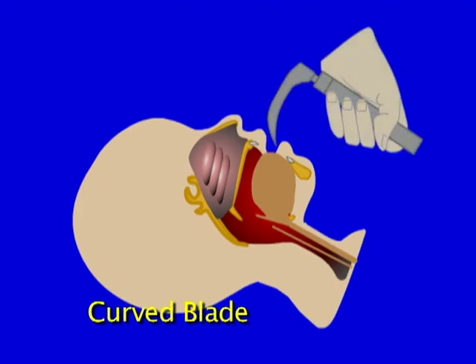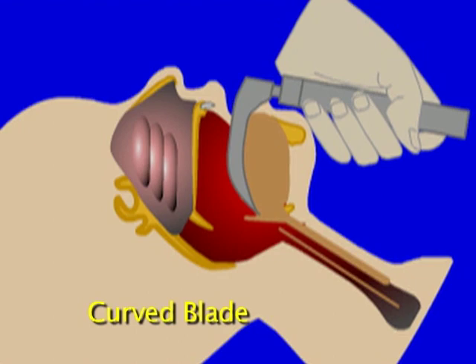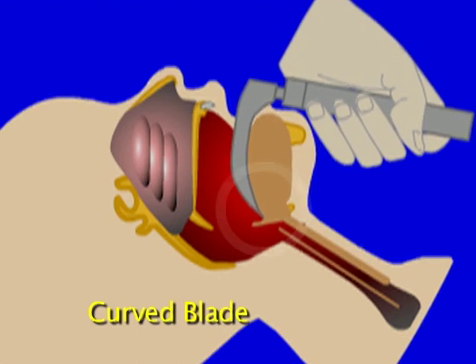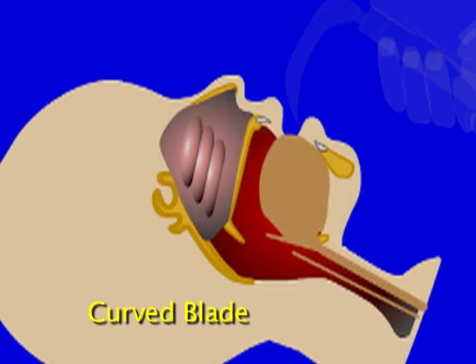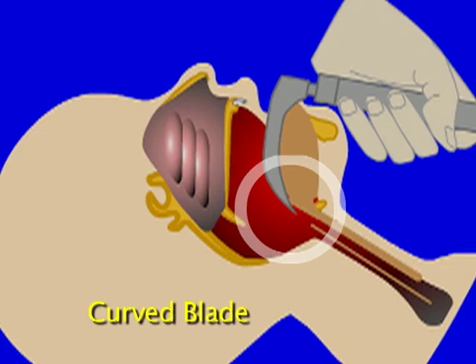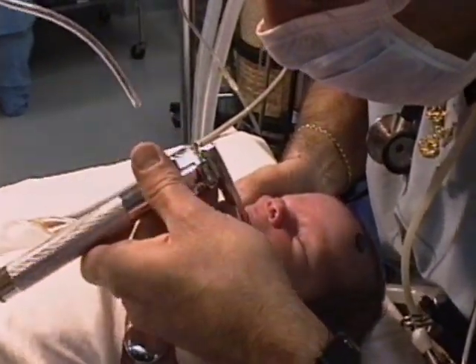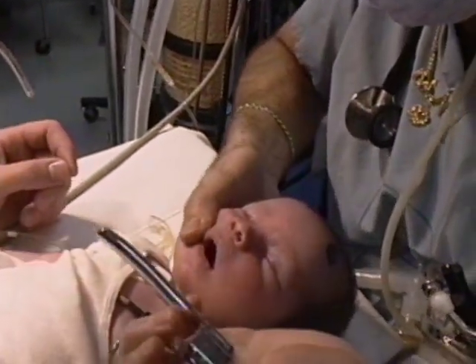However, in a child, the MAC will sometimes fold the child's epiglottis down over the larynx, blocking your view of the cords. When using a curved blade in a child, consider using it like a straight blade to lift the epiglottis if this is happening. Always check your equipment prior to use to avoid equipment failure at a critical moment.